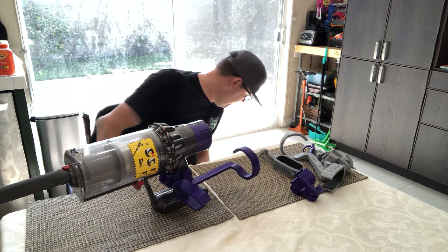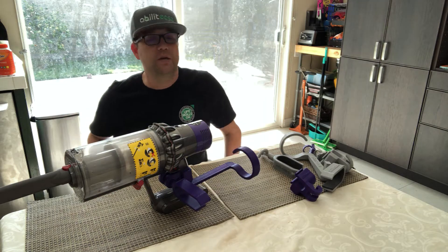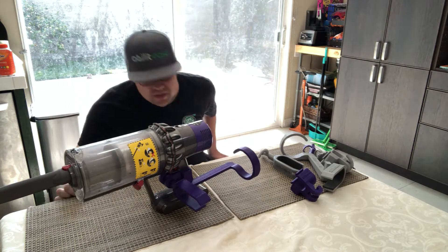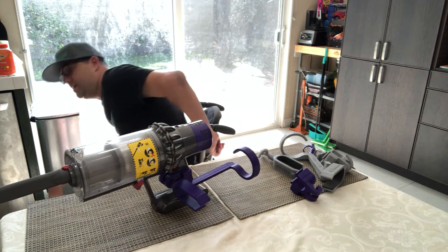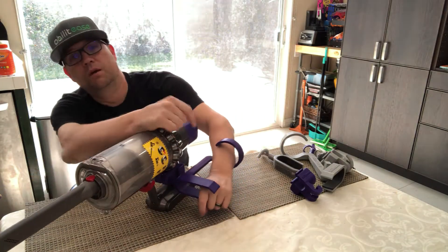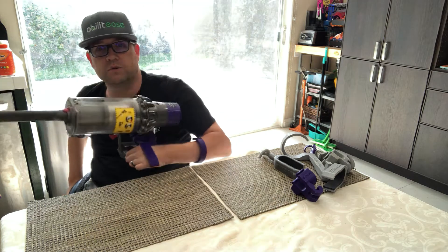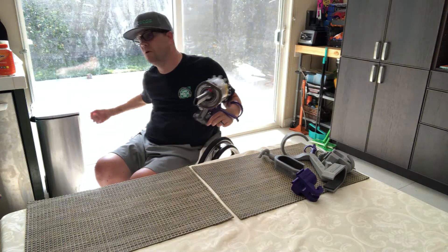I have power assist wheels which makes it a little easier, but on carpet it would be really hard to manage holding this and rolling around. My suggestion is to zero in on the place you're going to vacuum and then go for it. I have push handles on the back which let me get down really low. I put my hand over, slide it in, and with my hand on the cuff I turn to engage the trigger.